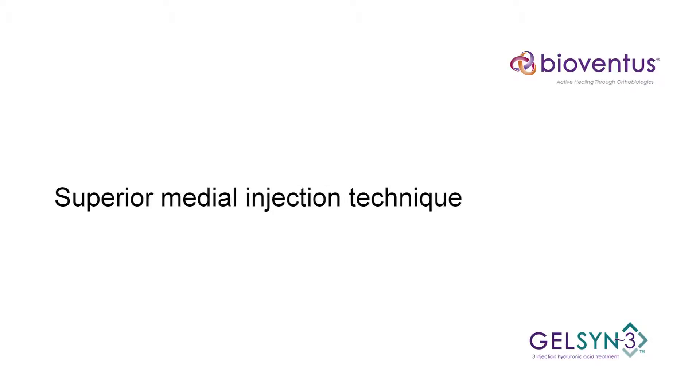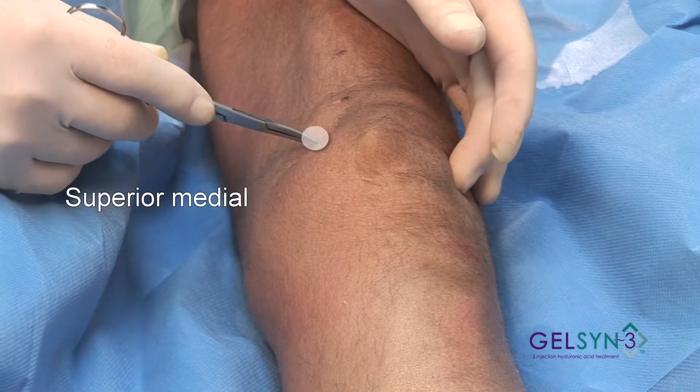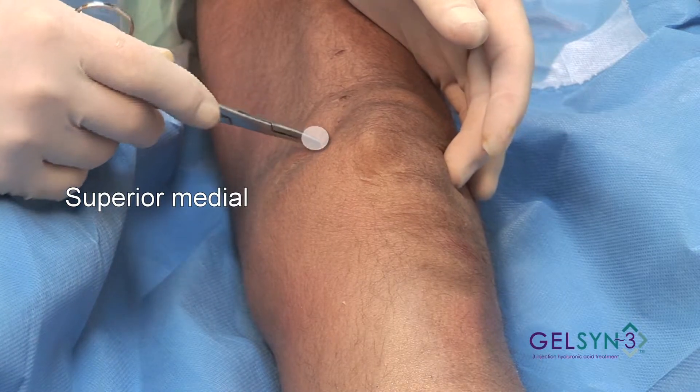Superior Medial Extended. Now we're going to approach this left knee from the medial side, and we're going to first use the superior medial portal.